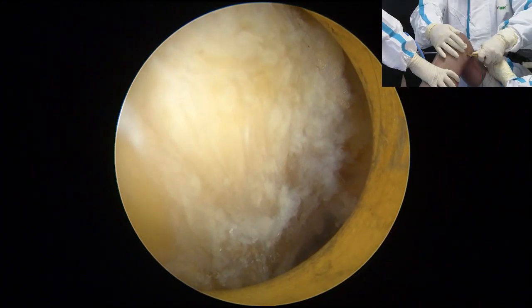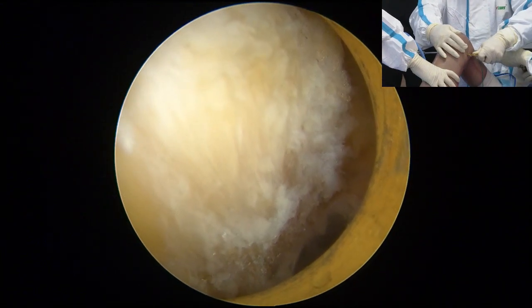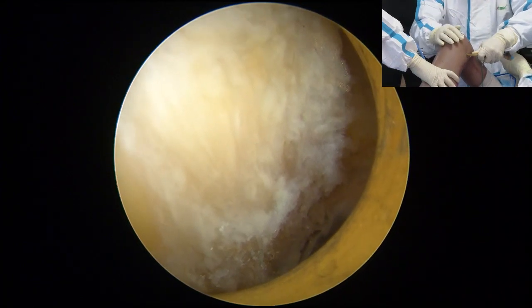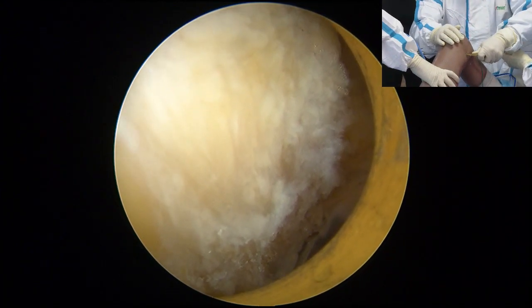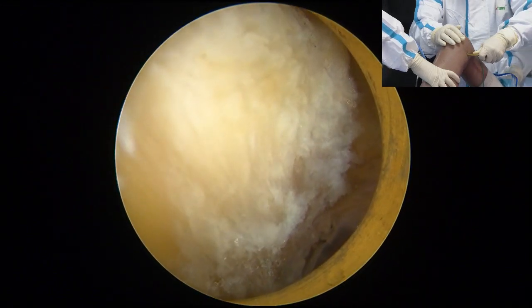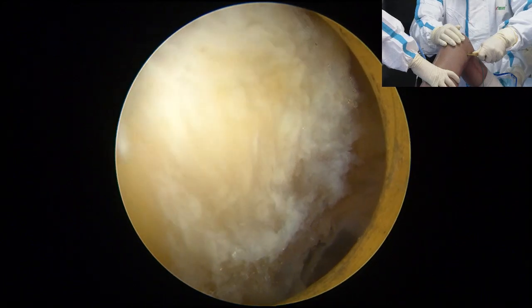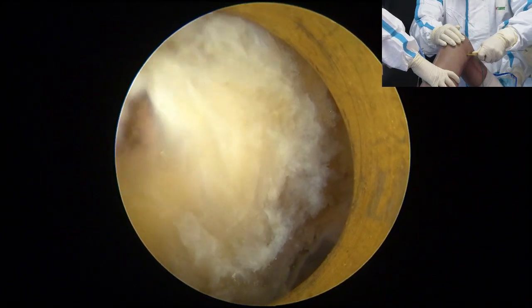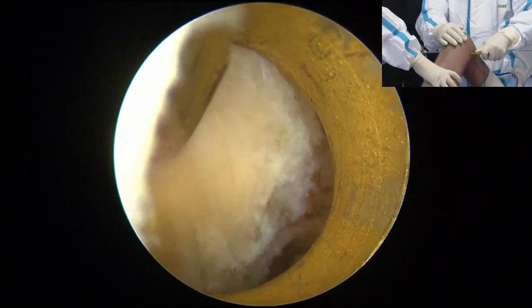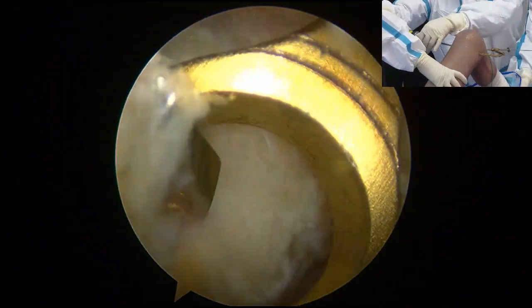Actually, the tool has a stopper. Okay, now, good. 那师傅会的工具上面呢，是有一个线圈装置的。You see here, we already measured. Oh, you can tap. So very important, you need to see under direct vision. 要直视下面。Coming. 用手动贯通最后这一步。Very good. Yeah, precise. 非常准确。Okay, precise. Good.